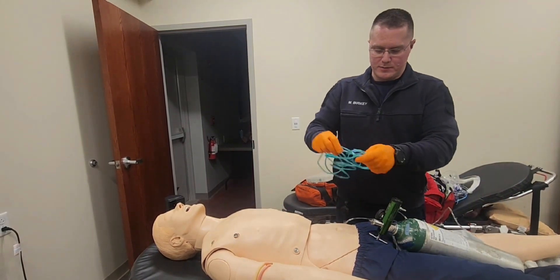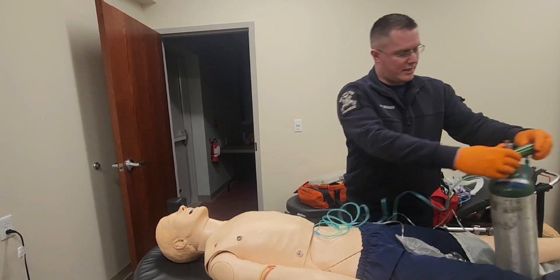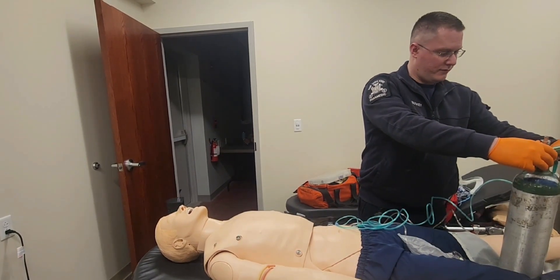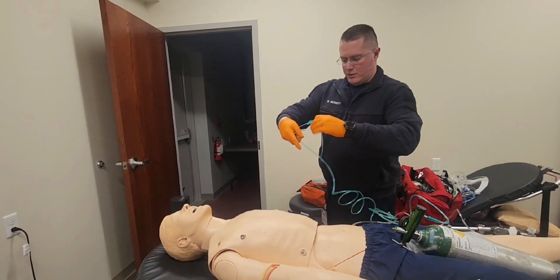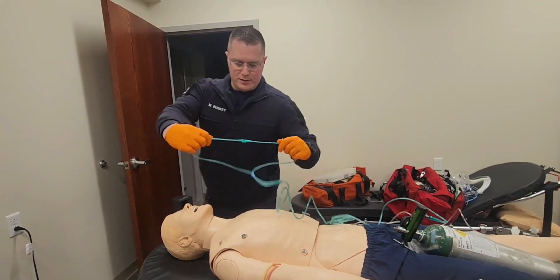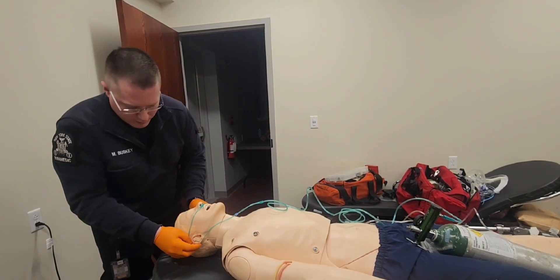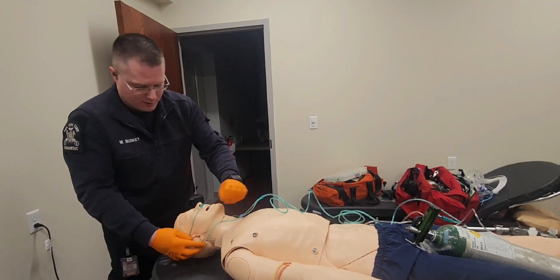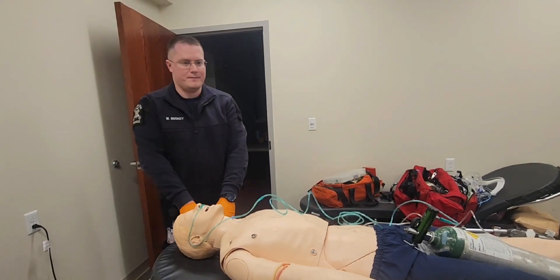I'll then attach my nasal cannula. I'm going to turn this to an oxygen flow rate of 4 liters per minute — I could go up to 6 liters if I wanted to. I'm going to put it into the mannequin and around the ears, then tighten the slider up. My nasal cannula is on the mannequin.